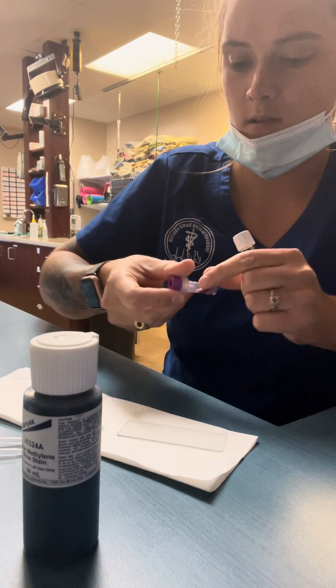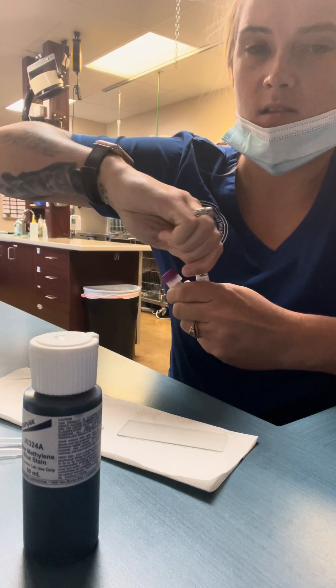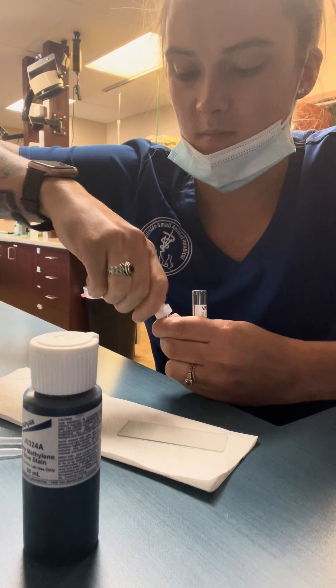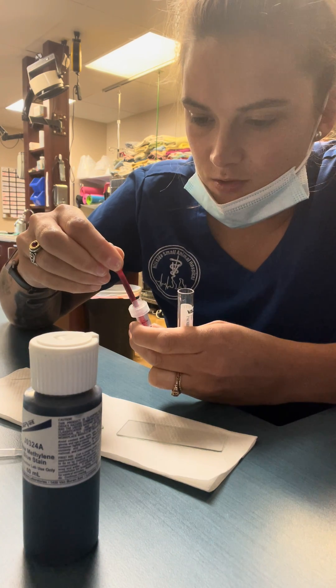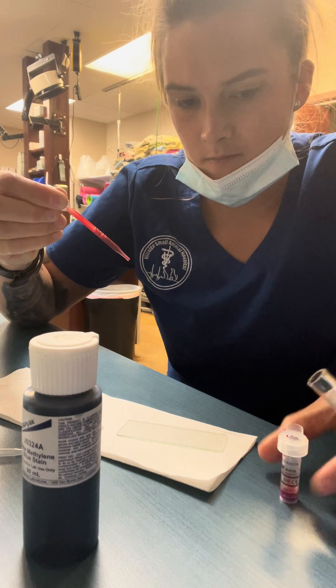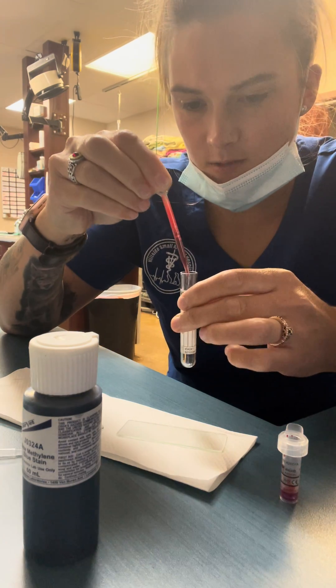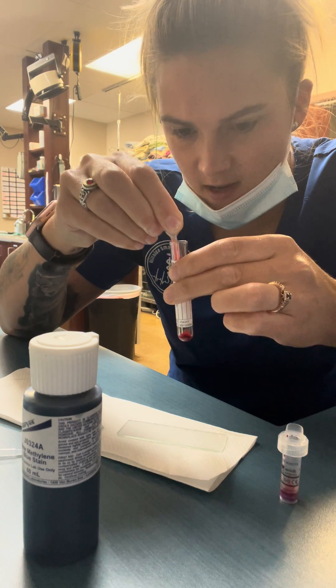First I'm gonna agitate my blood a little bit, take the top off my plain top tube, top off my blood. I'm gonna get five drops of blood — I'm gonna put the pipette all the way down in my tube. One, two, three, four, five.